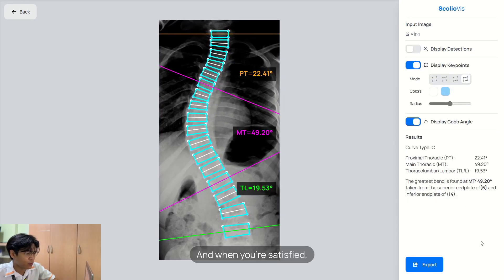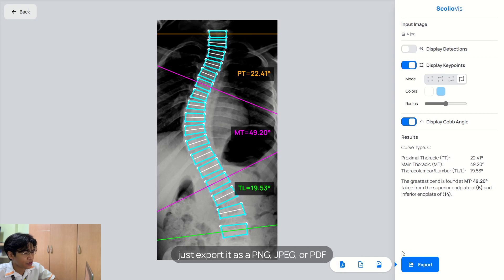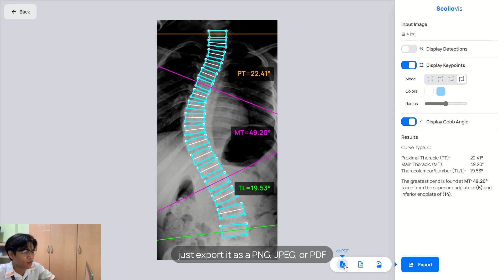And when you're satisfied, just export it as a PNG, JPEG, or PDF.